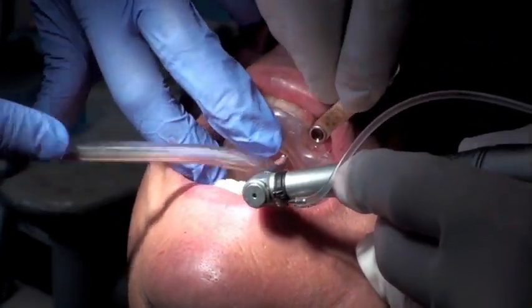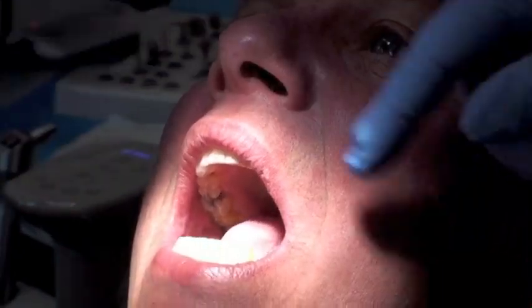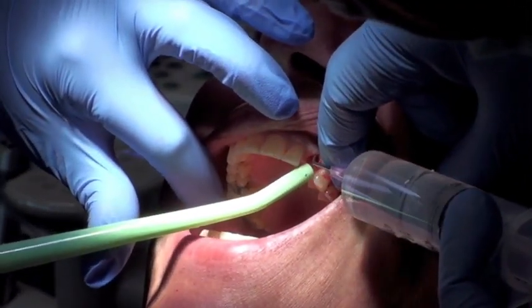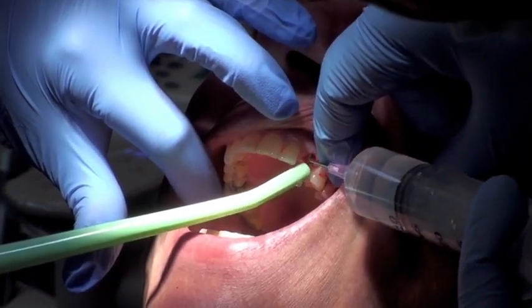I've shared this case with several surgeons in my hometown, and they each tell me that a surgery like this would be an hour and a half easy using conventional methods. Start to finish, we were finished with this patient, including attachment of the final prosthesis, in less than 20 minutes.